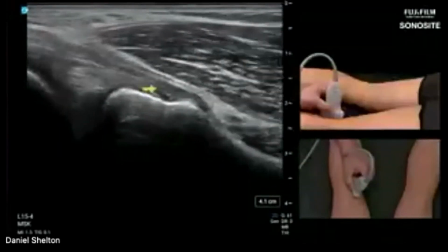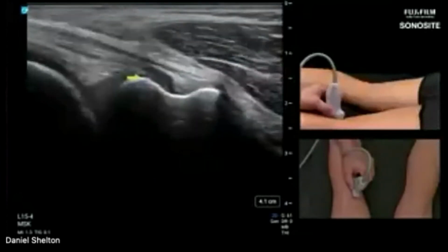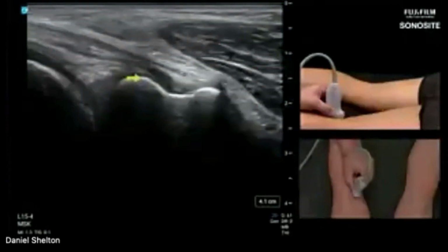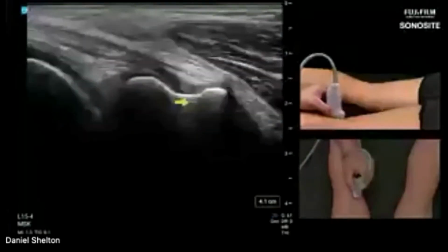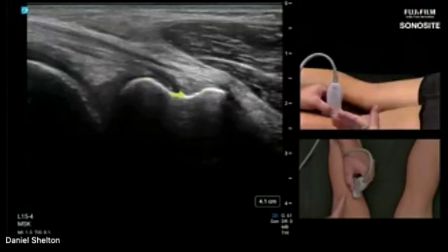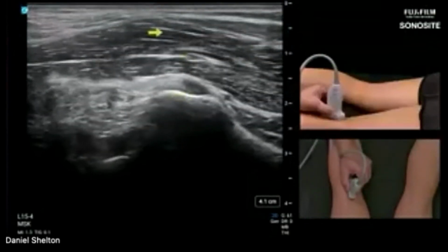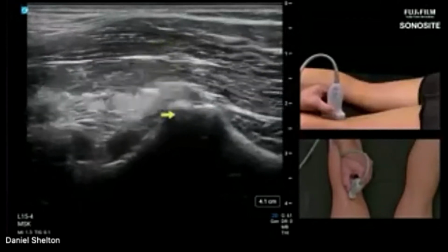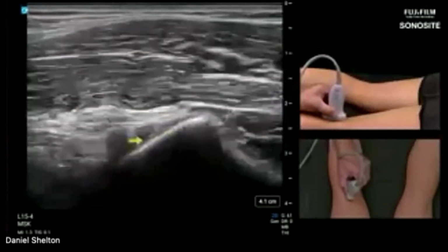So back to the semimembranosus, see that landmark. The reason is I don't want to call that the PCL by accident. If I'm chasing down the PCL, what I want to do is follow this tibial cortex, and I'm going to scan more lateral now. So I'm just going to bring the probe laterally. I see the medial head of the gastroc muscle. Notice how water-filled the muscle is. It's going to acoustically enhance what's underneath it, so everything gets nice and bright and makes it easier to see structures like this. So here's that distal PCL, just for fun.